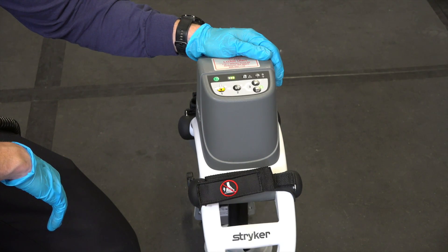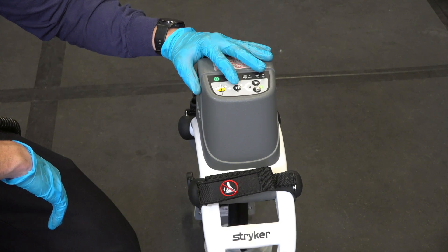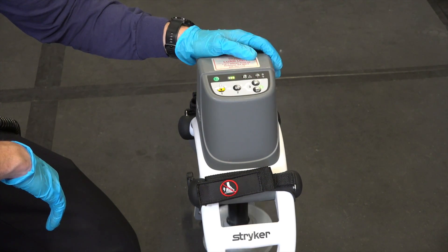If you need to check for a pulse, pre-charge the monitor, and when you're ready, hit the second button — it will bring the device into a pause mode where you can check your pulse. If you need to deliver a shock, go ahead and start compressions again by pushing the button and initiating compressions, and then you can deliver your shock. That covers the activation and the main features of the Lucas device.